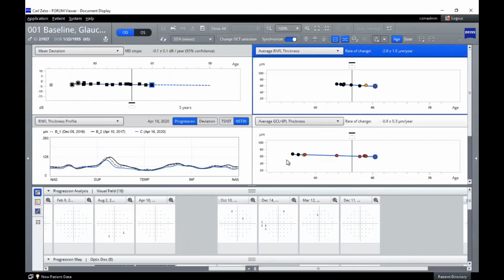I didn't have to dive back into my EMR, and I didn't have to check and see what other medication they might have been on through SureScripts or AllScripts. This is a powerful set of tools that are syncing these multiple modalities and allowing us, with confidence, to deliver this to patients. And I would say one last closing remark: when I show this to a patient, they can see what's happening with their condition. And I can tell you that every single patient that sees this understands and is more committed to their course of care because they can actually visualize it and they don't just have to take my word for it.